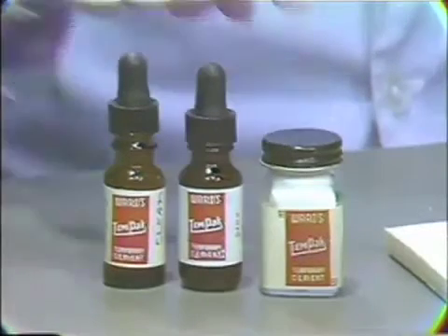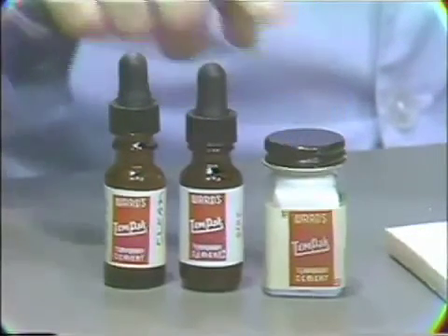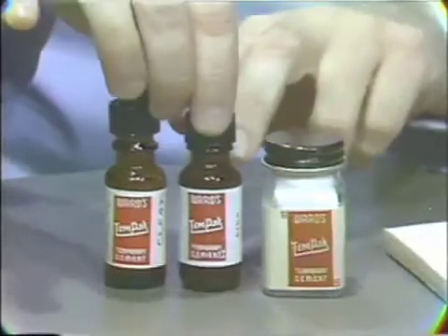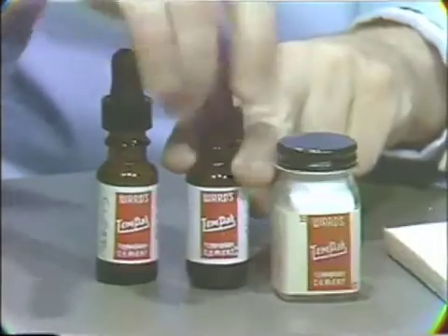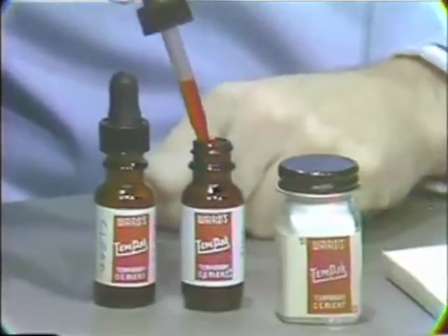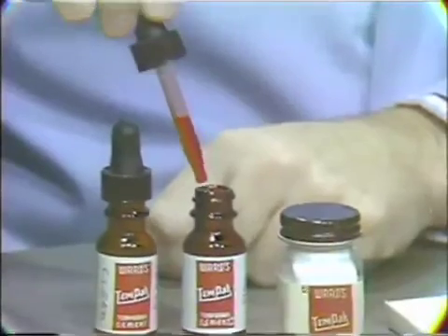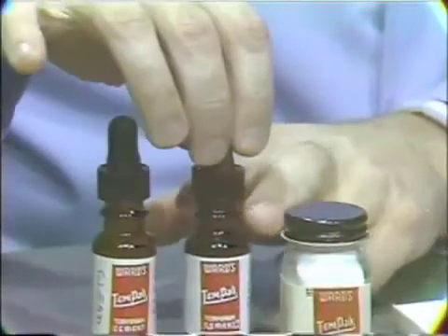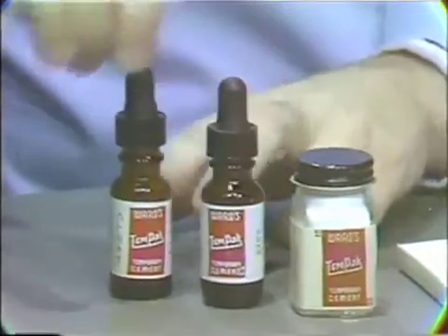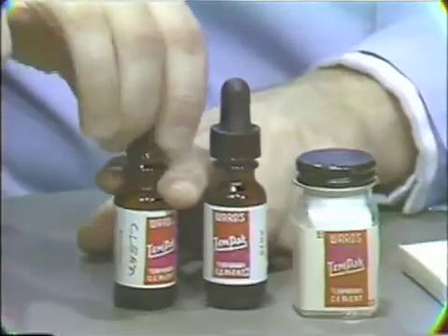It comes as a powder and with an alternative of two liquids. The powder is basically a zinc oxide powder, and the material in its normal form is a pink liquid, which makes the mixed cement very easily detected against the white cavity walls of the preparation into which it's inserted.